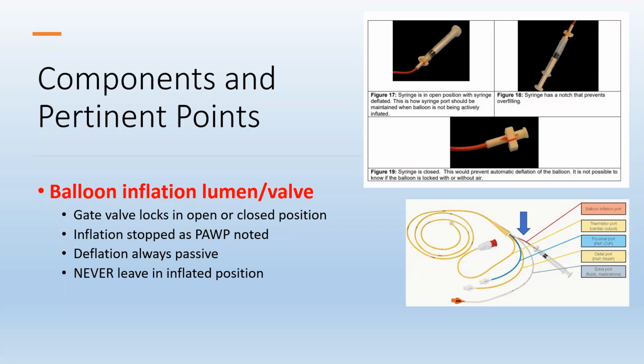If the catheter whips the right ventricle, what is going to happen? What do you think will happen if we whip or beat the endocardial layers of the right ventricle? Well, actually, it will cause ventricular tachycardia and ventricular fibrillation.